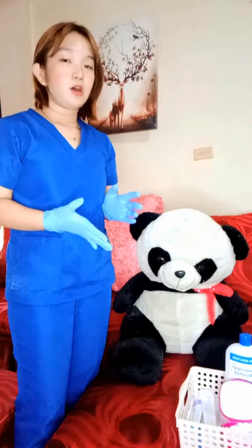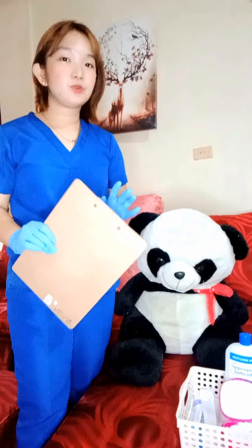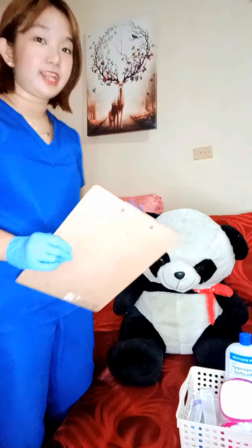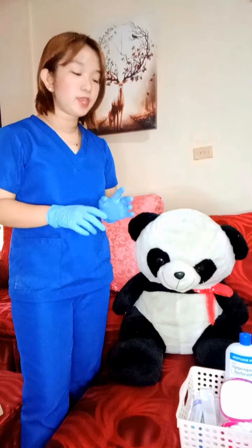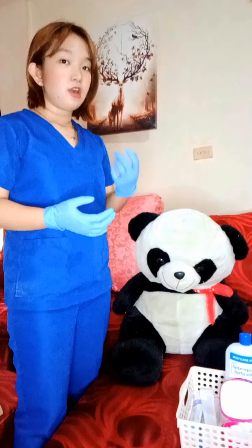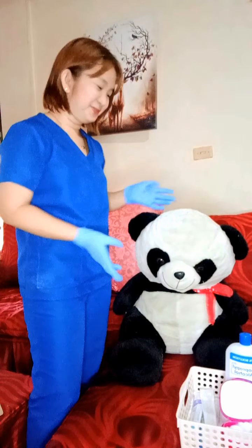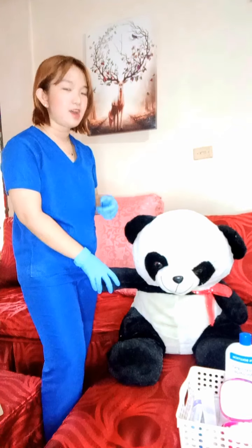The third step of the procedure is to provide the client's privacy. It is part of the right to privacy. The fourth step of the procedure is to confirm the client's identification and information. You can ask their name, age, address, and personal information. The fifth step of the procedure is to position the client. It is important to position the client so we can have a comfortable way of administering medication. As you can see, I'm using a teddy bear panda, and I'm using his left arm for the injection.